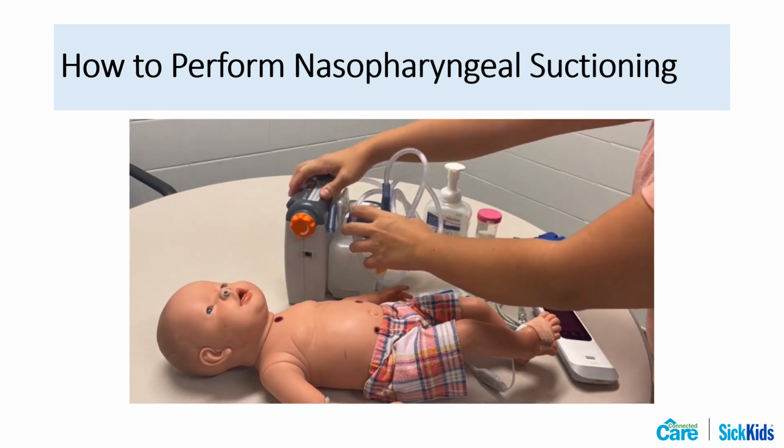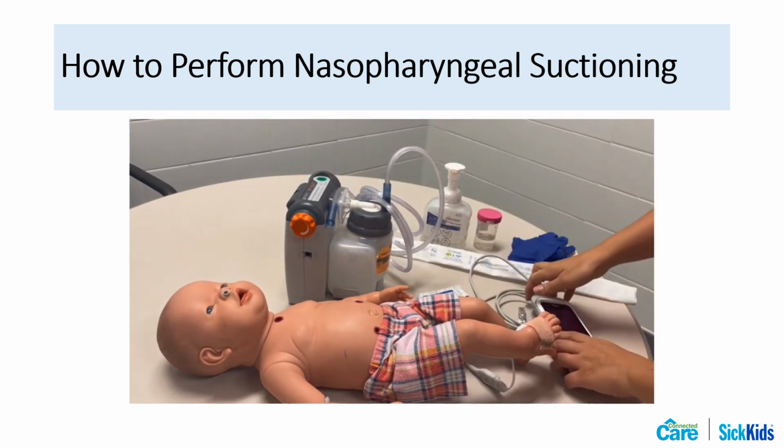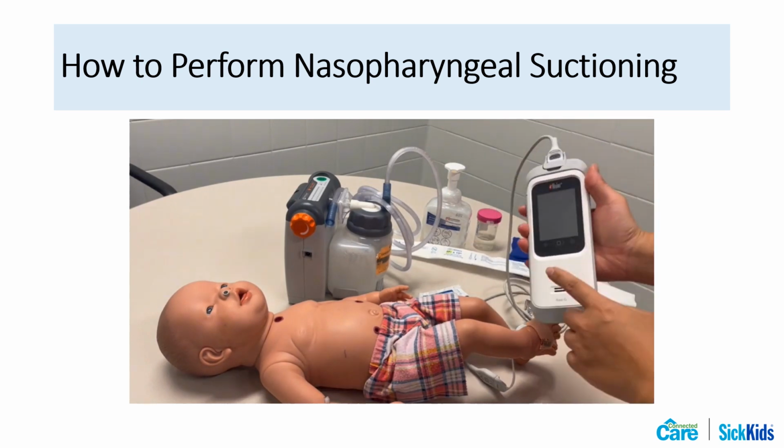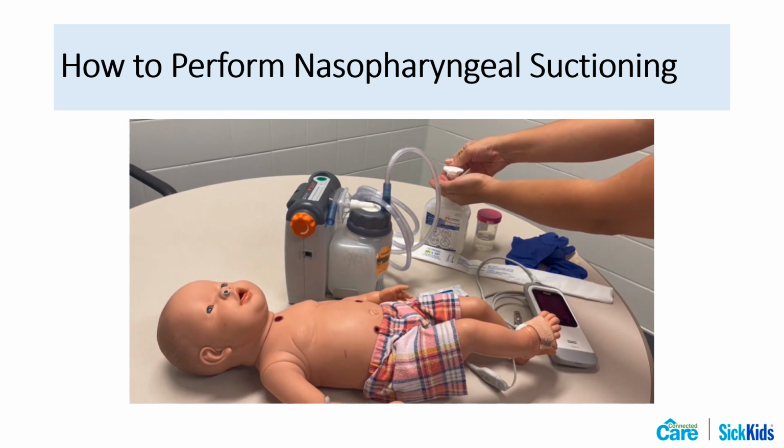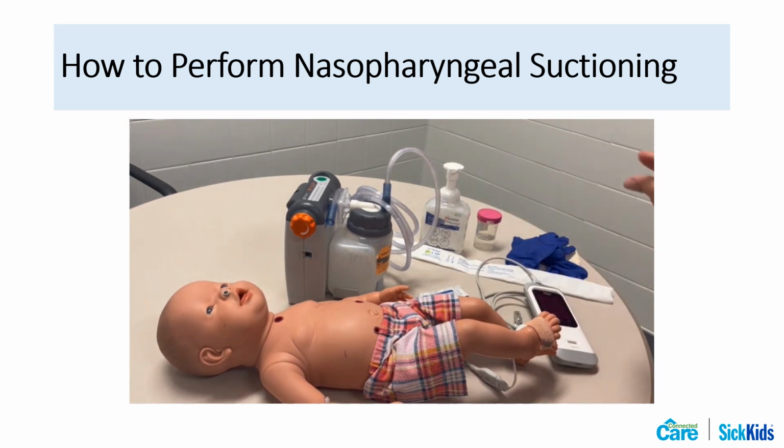If your child uses an oximeter, make sure it's on and providing an accurate reading. For demonstration purposes, the oximeter will be off. Wash your hands well and wear appropriate PPE. Have oxygen available if prescribed by your child's healthcare team.